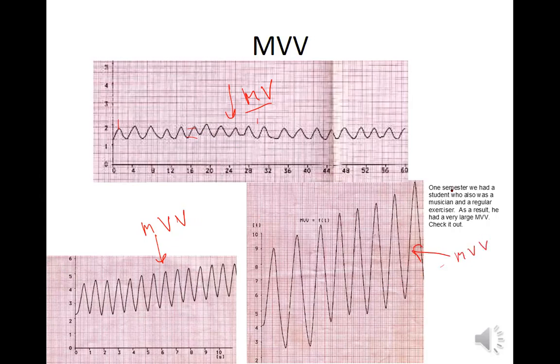So here's the catch now. These are 2 different people. This is like patient 1, this is patient 2. They're 2 different people, so the demographics are going to be completely different. It's like me and Nava. Well, Nava's probably got better MVV than I do. But that doesn't matter, because you're taking the predicted value, what you predict for Finizio, or what you predict for Nava, and then you divide that into the actual to get at least 80%, then you can say it's normal.